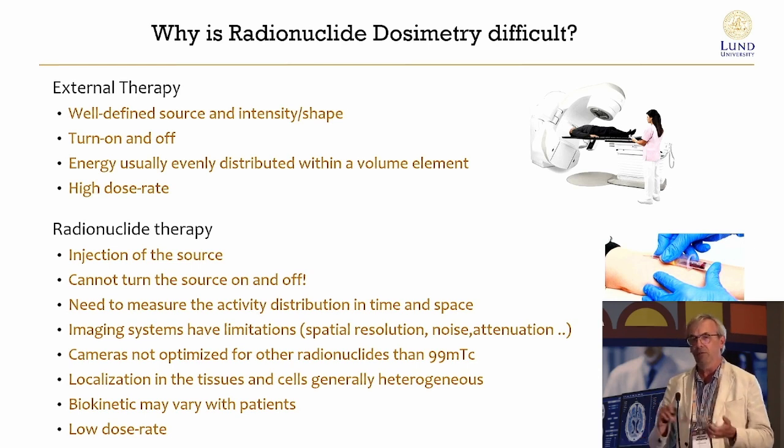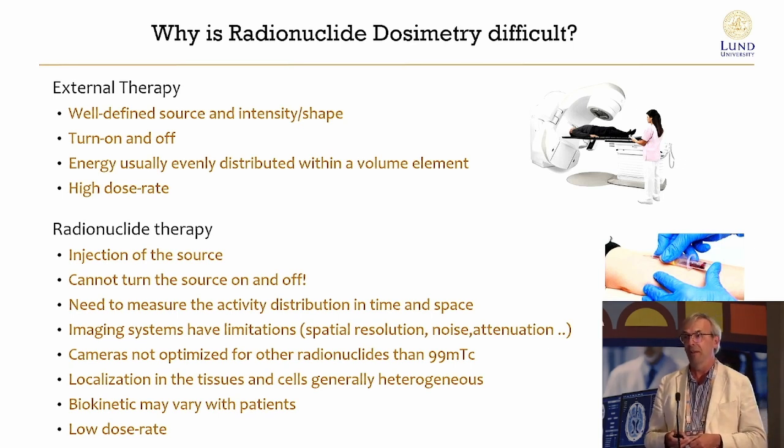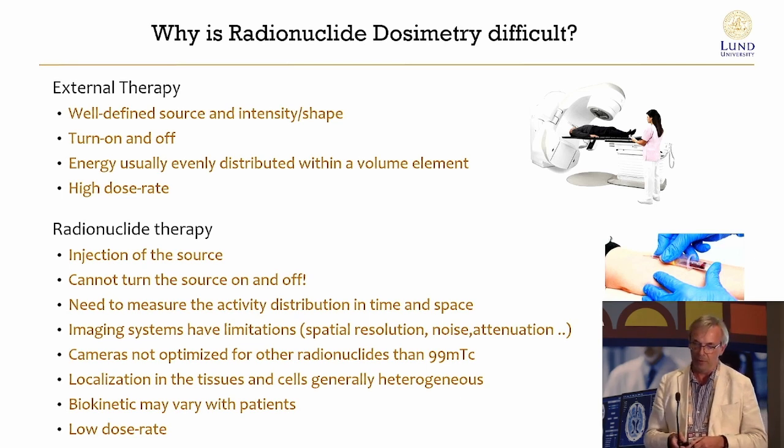We can't turn it off, we can't turn it on. It's a radioactive decay that can last for quite a long time. We have our imaging systems, but they are not really good. They're okay, but they are not good in terms of measuring spatial information. So we don't really see exactly the distribution.